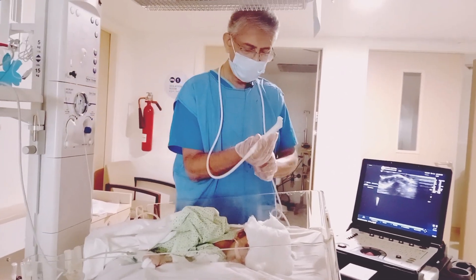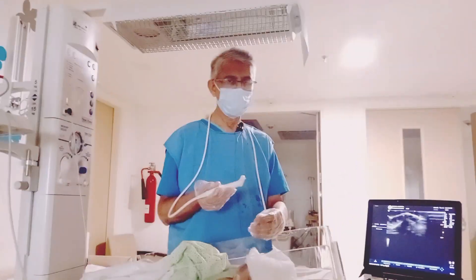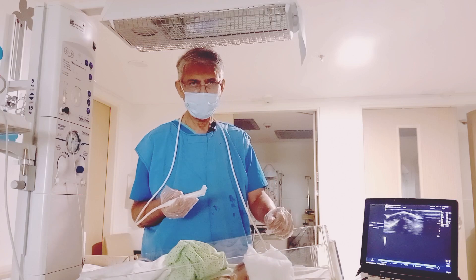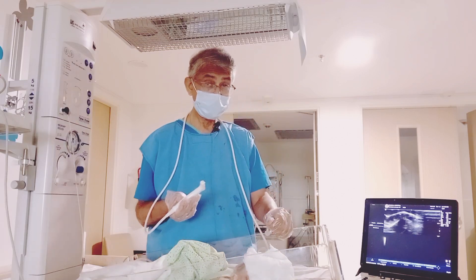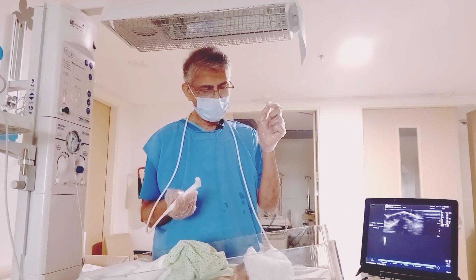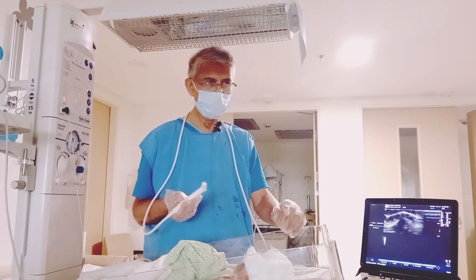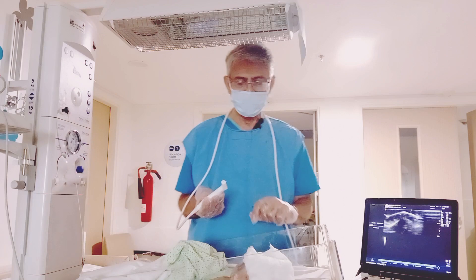Routinely, radial artery is cannulated blindly — just putting a cannula into the radial artery without any aid. But most units now use ultrasound, especially Doppler ultrasound, to identify the artery and cannulate. The failure rates will be very low if you utilize Doppler ultrasound for radial artery cannulation.